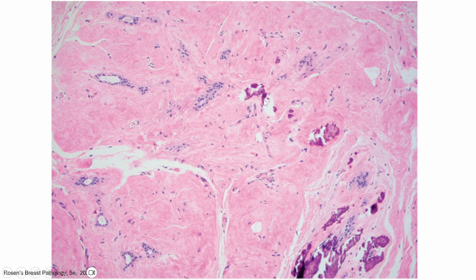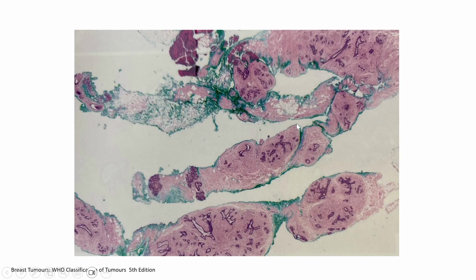And this image would like to show you that inside the fibroadenoma, other than these 2 components, you may also see calcification. This is a core needle biopsy. We can see a well-demarcated mass, and then we see epithelial component proliferation and also stromal proliferation. So this is a fibroadenoma from a core biopsy.